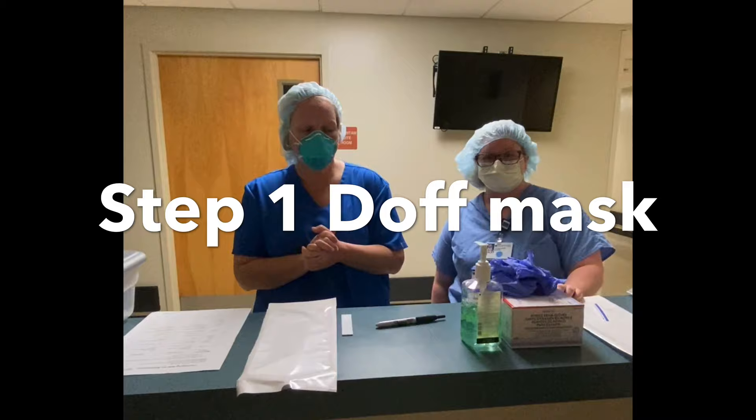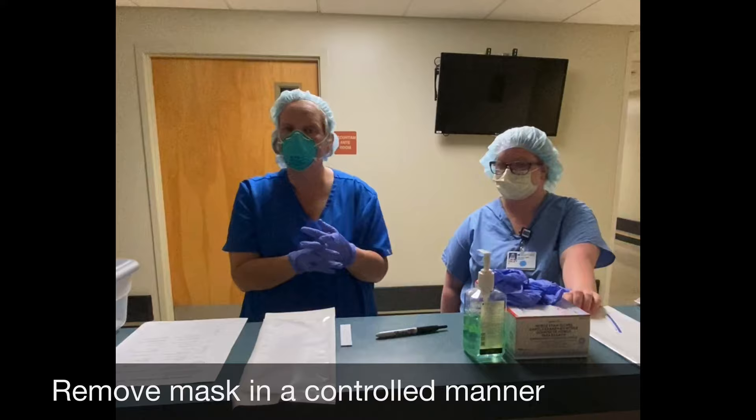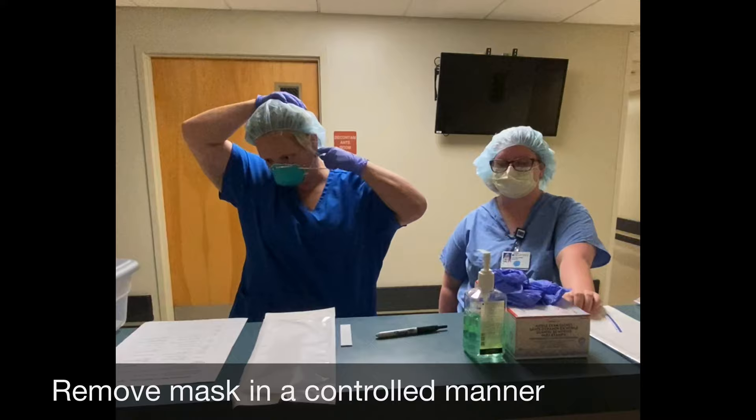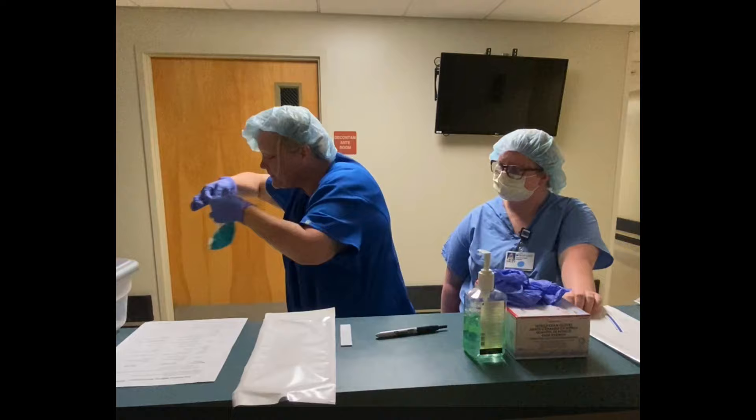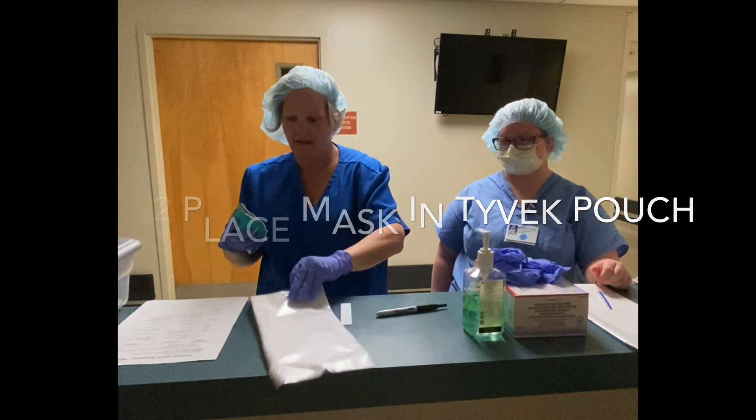Now it's time to doff the mask. The first thing we're going to do is don gloves. Key point number two is to remove the mask in a controlled manner. Key point number three, perform visual inspection. Important step number two, place the mask into the Tyvek pouch. Key point: the outside of the mask has to be showing through the clear plastic.